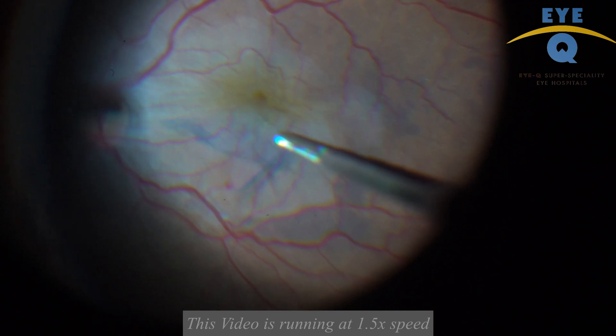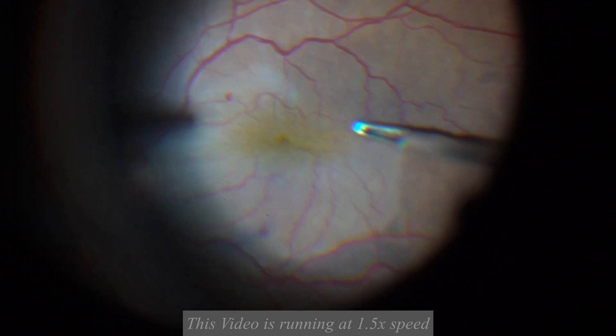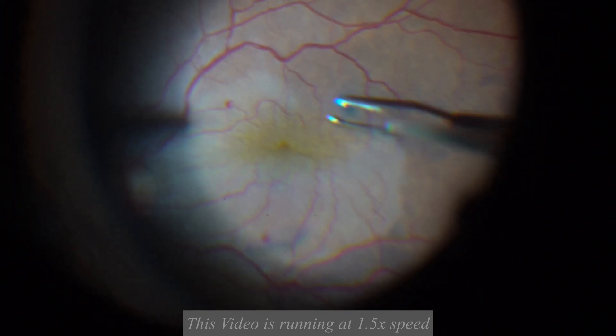Once the fovea is free from ERM and ILM, you can go back to your original plan for peeling.